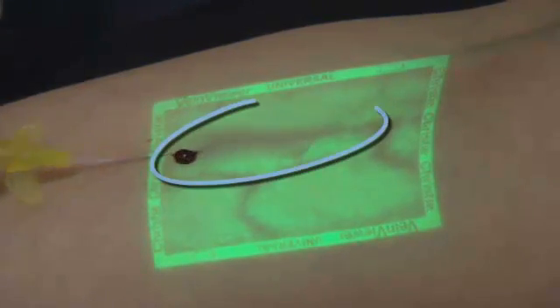Here the catheter is slowly removed to simulate the visualization of an infiltrated vein.